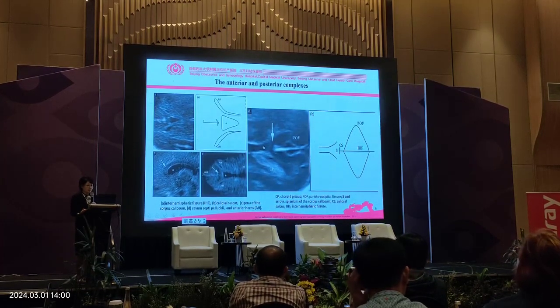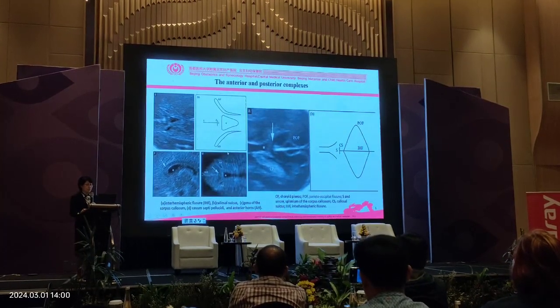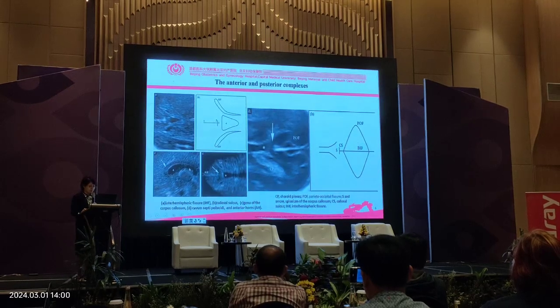So we should not only observe the anterior complex of the fetal brain, we should also observe the posterior complex, the corpus callosum.